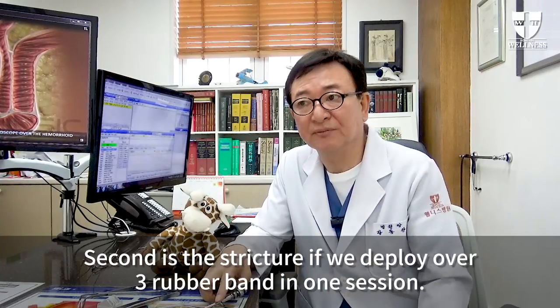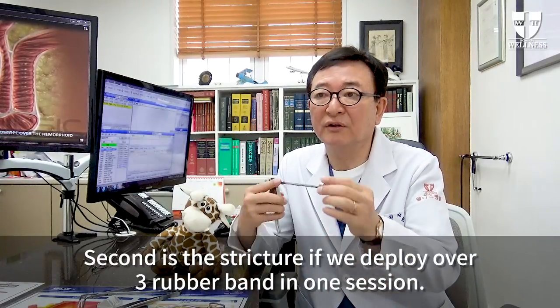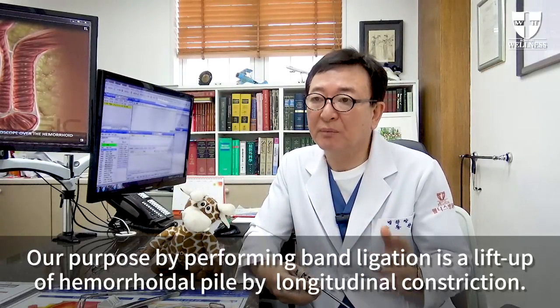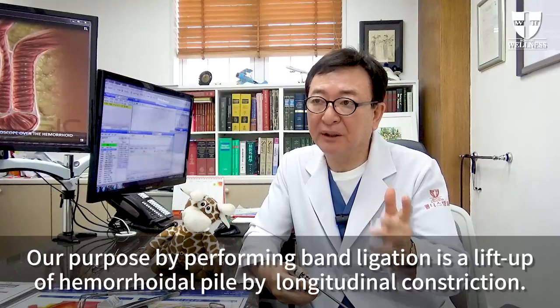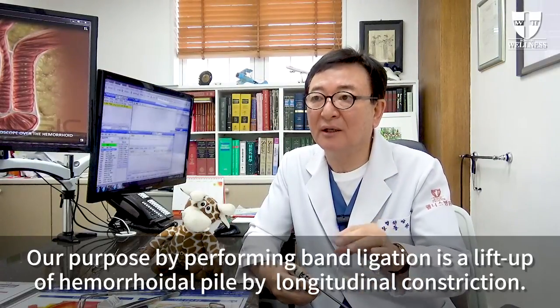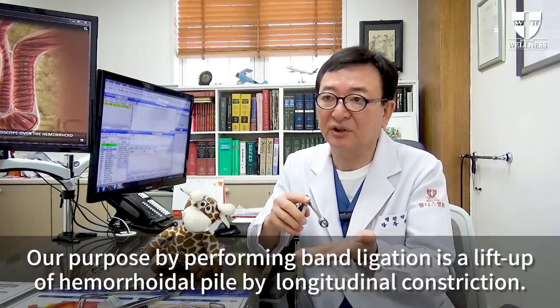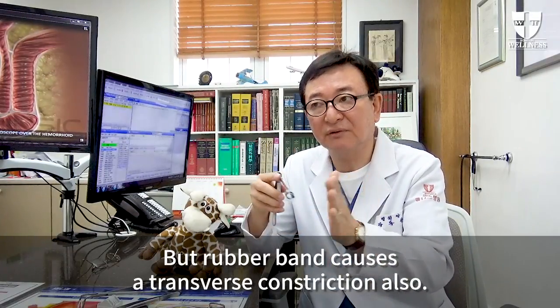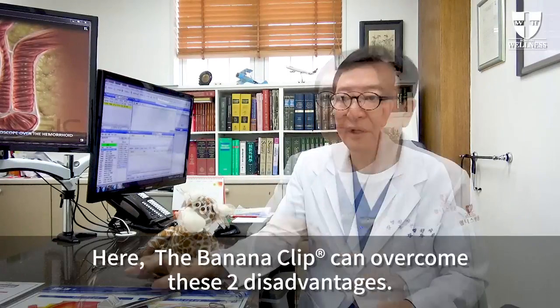Second is the stricture. If we deploy over three rubber bands in one session, our purpose by performing rubber band ligation is a lift up of hemorrhoidal pile by longitudinal constriction. But the rubber band causes a transverse constriction also.